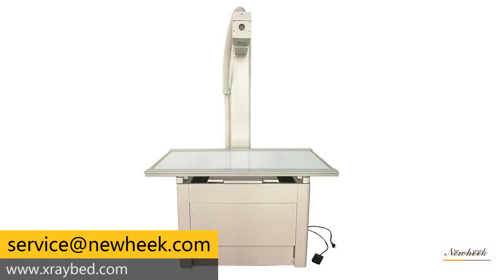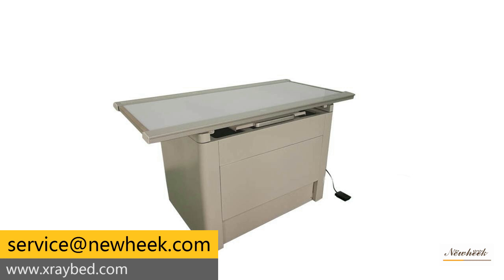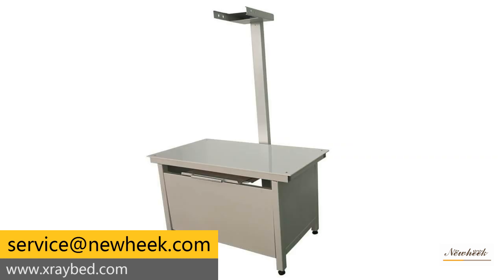A veterinary x-ray table is an important part of veterinary x-ray machines. A small veterinary x-ray table is an x-ray examination instrument for domestic pets or animals in veterinary stations, and is a multi-functional medical equipment. Animal x-ray machines and human x-ray machines share the same principle — x-rays belong to ionizing radiation.